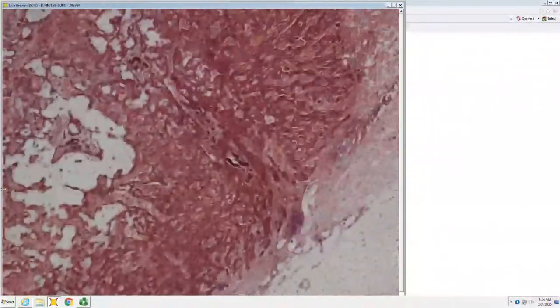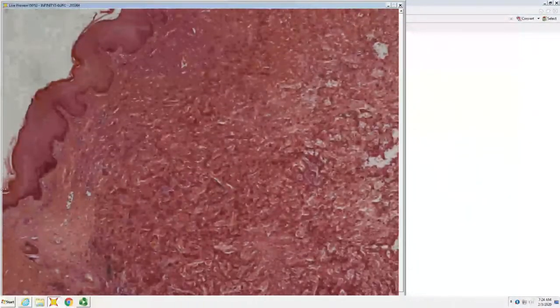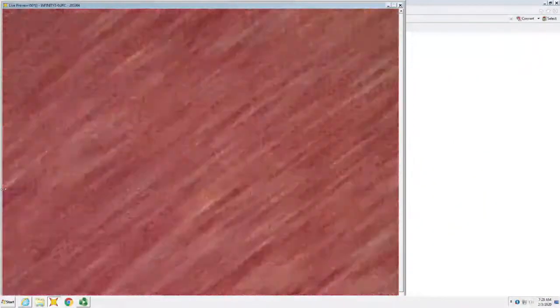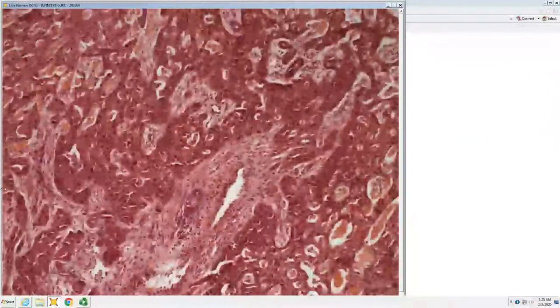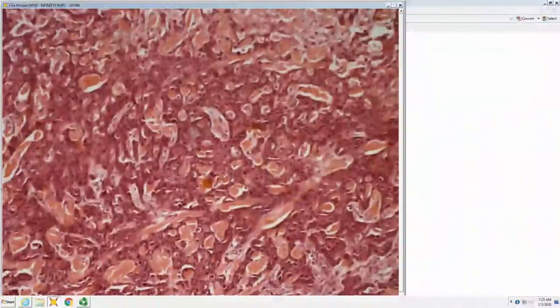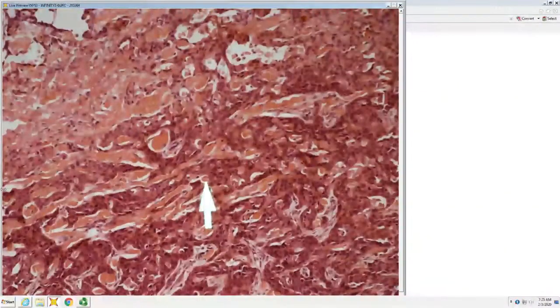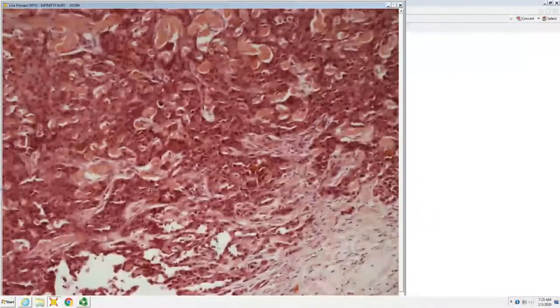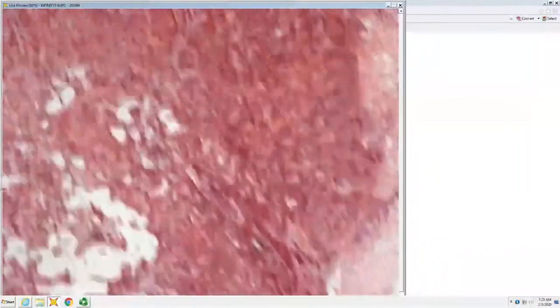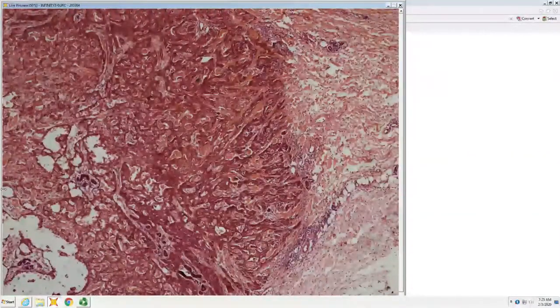So, yeah, what do you think? Is it lung carcinoma? So, this particular one could be. I don't see evidence of adeno differentiation. In fact, I see some areas that look like single cell keratinization. You have to distinguish that from trapped collagen, but that looks like maybe a keratinizing cell. You could confirm with high molecular weight keratins. Low molecular weight tend to be an adenocarcinoma, high molecular weight in squamous cell carcinoma. This one would stain as a squamous cell carcinoma.